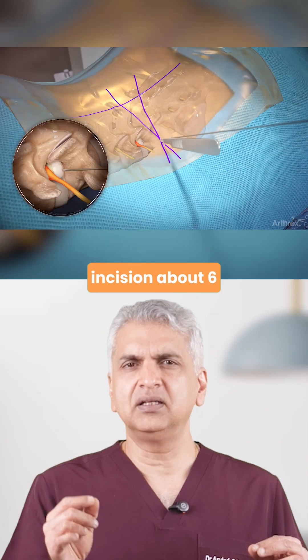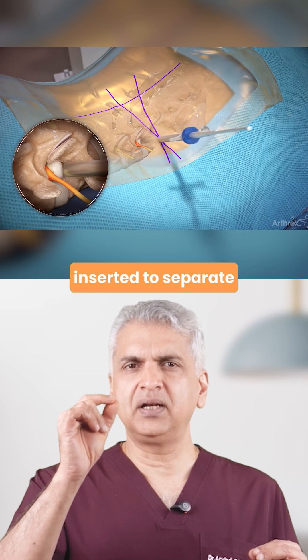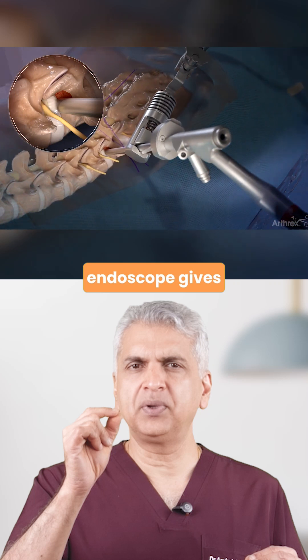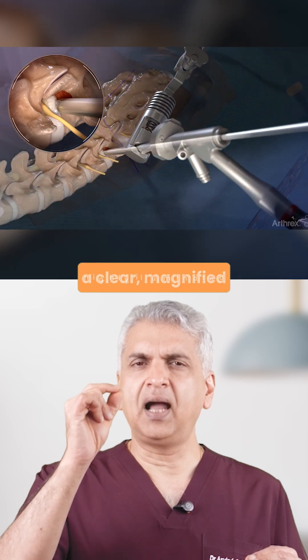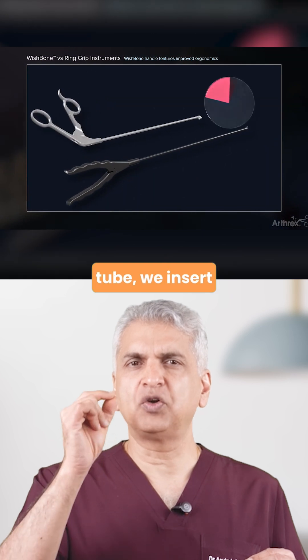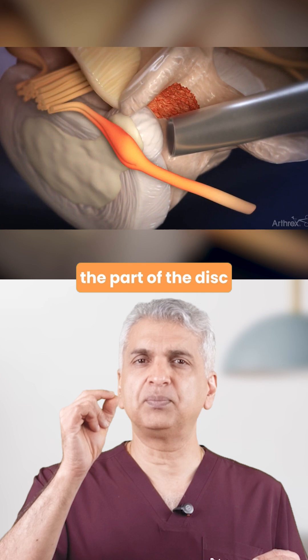It's a very tiny incision, about 6mm wide. A narrow endoscope is inserted to separate muscle fibres, not cut through them. A very high definition endoscope gives a clear, magnified, highly illuminated picture of the spine. Through that same tube, we insert sophisticated, sharp, precise instruments to remove the part of the disc pressing on the nerve.